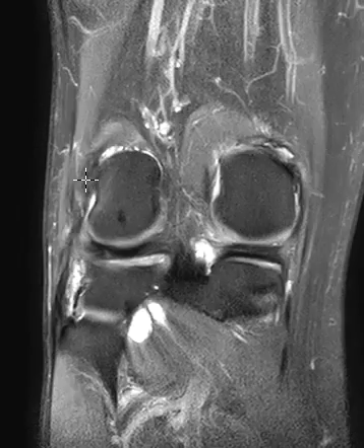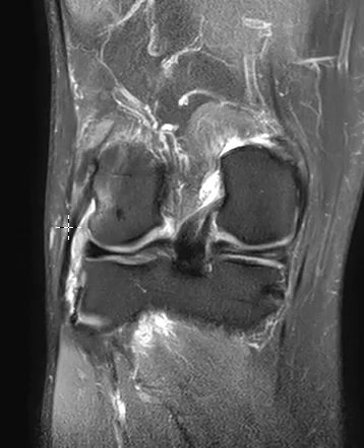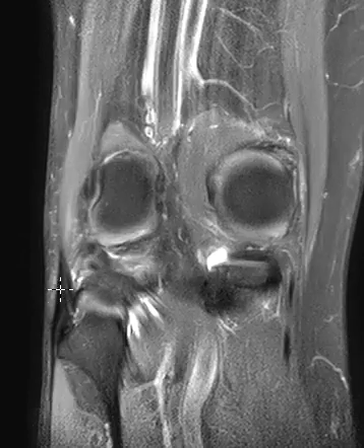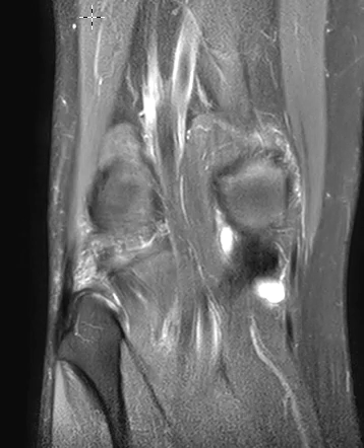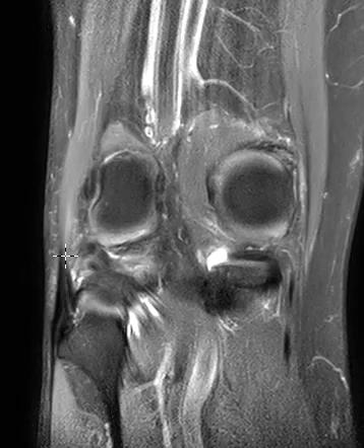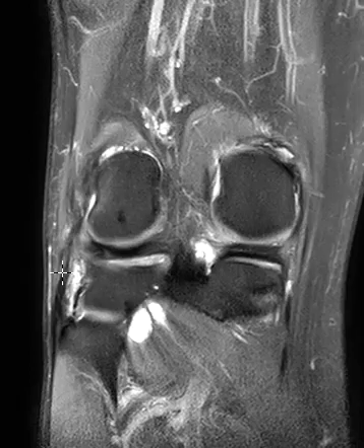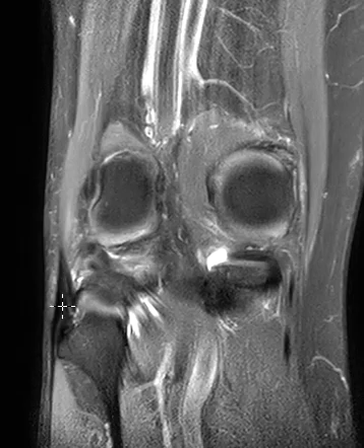If we go down low, we see the conjoined tendon. This blends and becomes the conjoined tendon — it blends with the biceps muscle. Here's the biceps coming down, this gray muscle, and it comes down and turns into the tendon. Its tendinous attachment joins with the fibular collateral ligament to form the common conjoined tendon that comes down to the fibula.